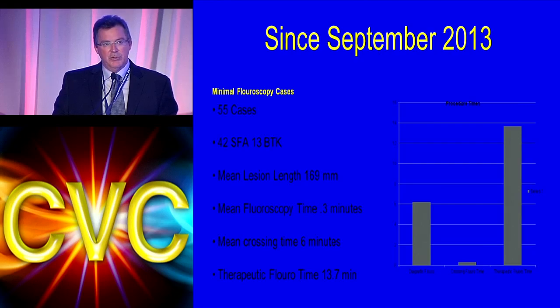I think when you stay within a true lumen, which this gives you, your intervention becomes a lot easier for you to do, no matter what you're going to do, whether it's stenting, because you can adequately prep the vessel with that. If you're going to do atherectomy, you stay within the true lumen, have a much better chance of success. And I think even drug-coated balloons in the future might be better off truly within a true lumen.